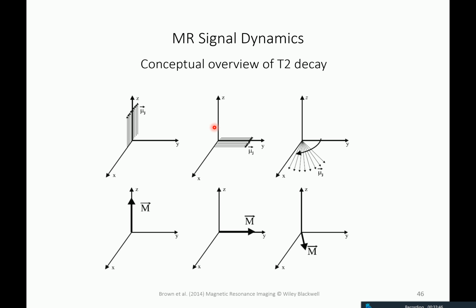The quantum theory one can develop along in some way equivalent to the classical viewpoint, but we are focusing more on the classical mechanics viewpoint, and we take some inspiration from the quantum spin stuff when it fits us, but mostly we ignore it. This is why I'm not really happy about always talking about spins when one looks at these kinds of graphs. This is why I'm now saying nuclear magnets more, because spin always sounds like quantum theory, where you have this discrete thing.